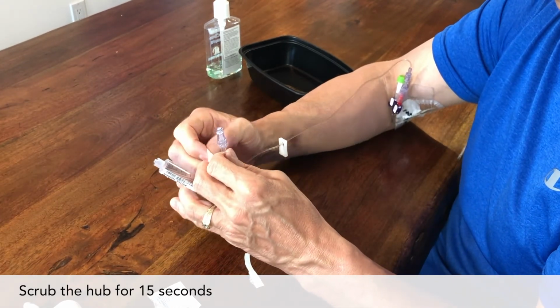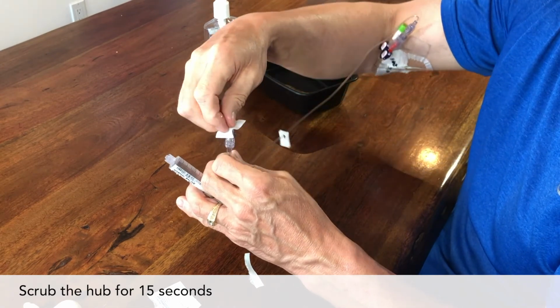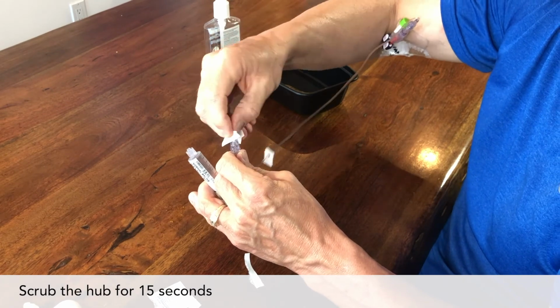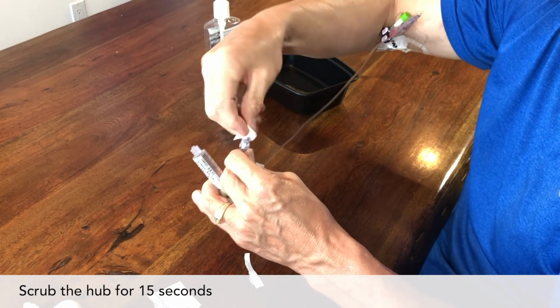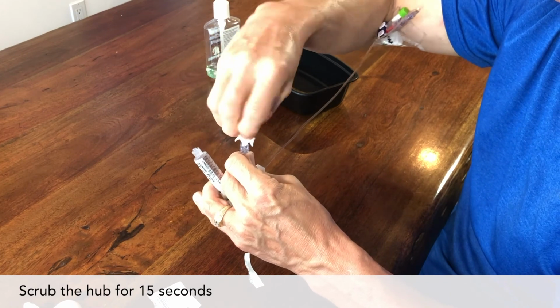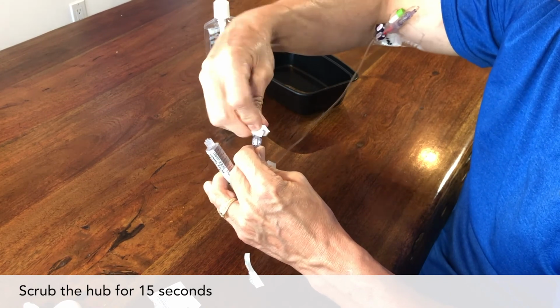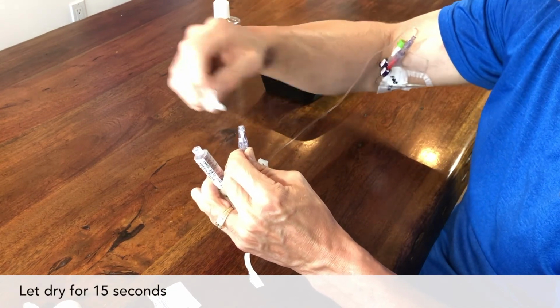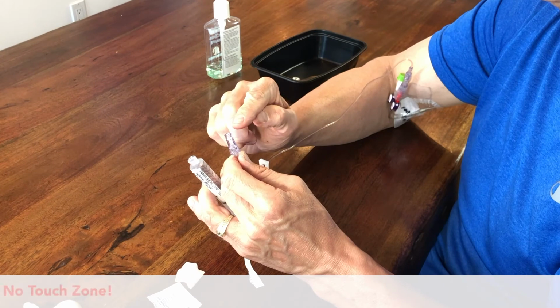Scrub the top and sides of the IV cap for 15 seconds, or however long you were taught. And then let it dry for 15 seconds. Now this is a no-touch zone. Nothing can touch the clean end but the tip of your flush. If you did touch it to something, you would need to get another alcohol swab and re-clean it.